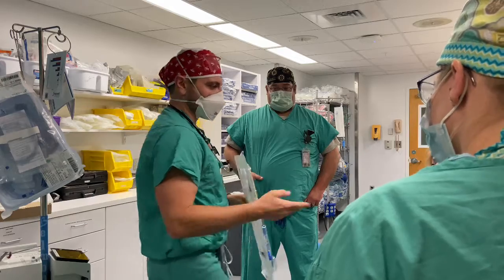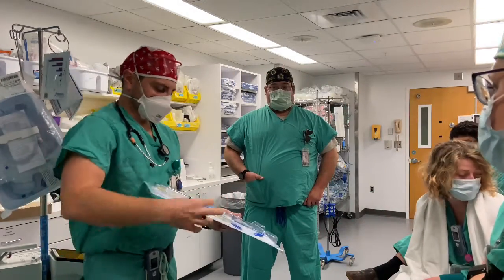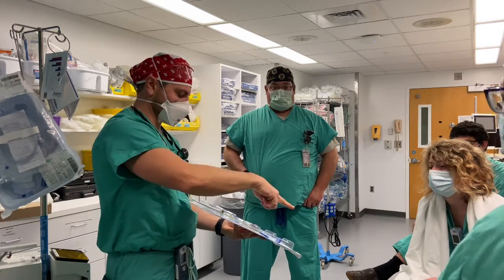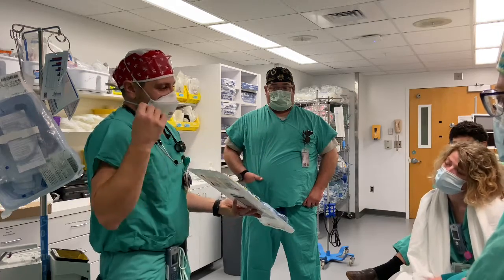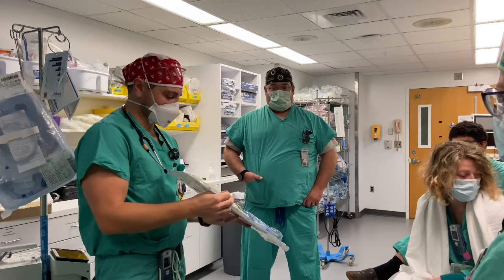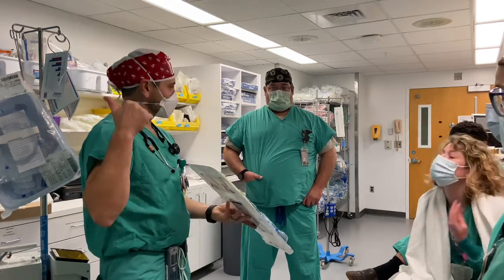Okay, so like what we were doing with this balloon down here to isolate one side from the other, you take this device through a single lumen tube, feed it through, put the balloon where you want it, and inflate. All of that's very similar to a double lumen tube. The only thing that really is a challenge with blockers most of the time is getting the lung that you want to work on to deflate.